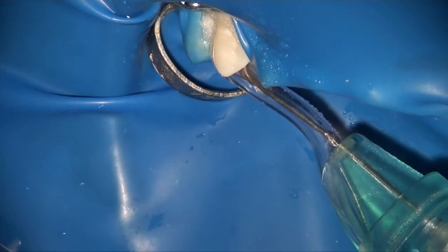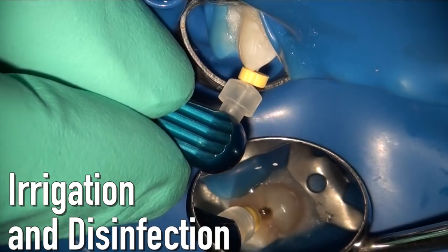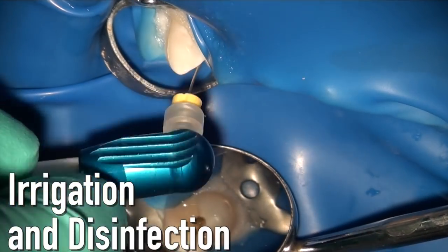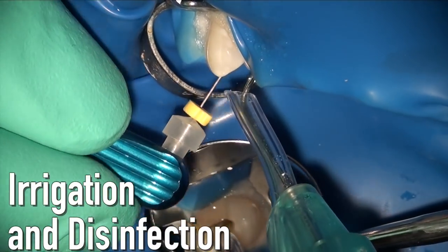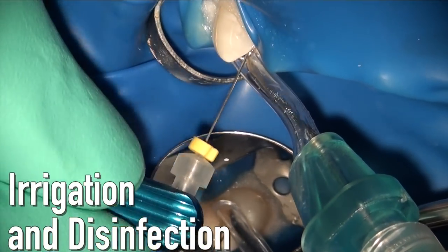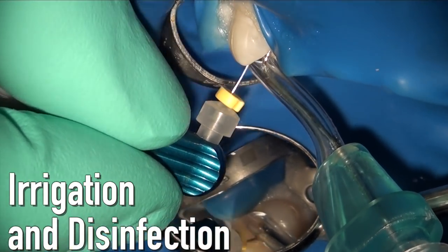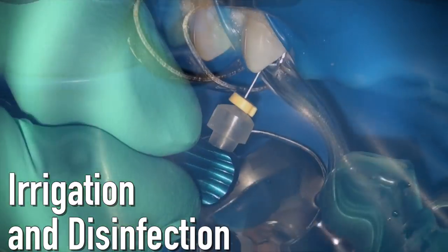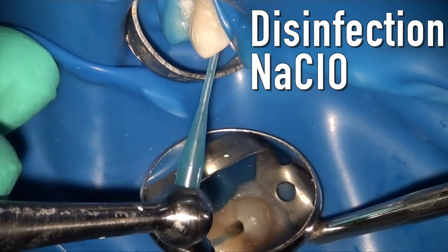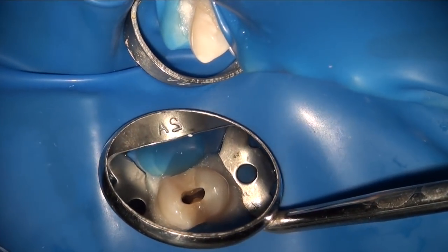We now have 24 millimeters prepared with a size 3504 ESX file on both the buccal and lingual sides. Now it's time to do the final disinfection — I'm using a negative pressure technique by putting the vacuum at the apex of the tooth and adding hypochlorite on top. You may prefer a positive pressure system — just make sure you stay passive with a side-vented needle that doesn't get locked in, and try to irrigate with a large volume of irrigant. I use full-strength hypochlorite because I use negative pressure, but if you're using positive pressure you may want a diluted form to increase safety.